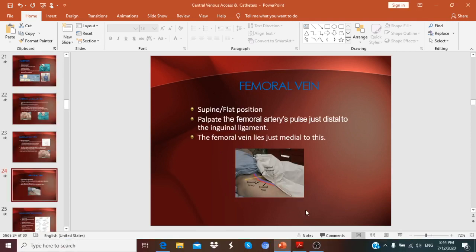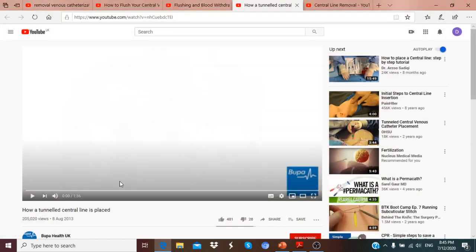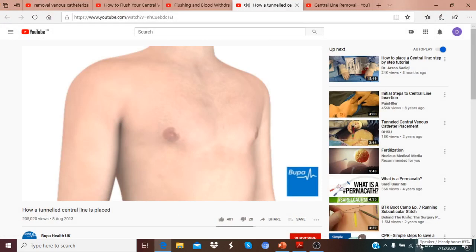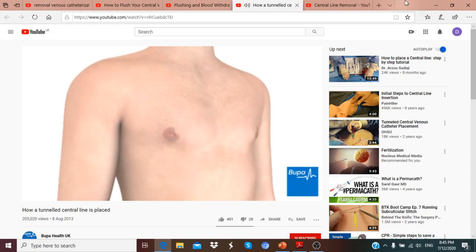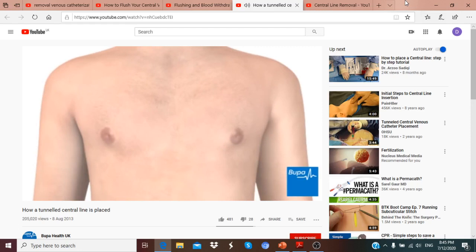Non-tunneled catheters are percutaneous. We have discussed the advantages, disadvantages, and techniques for insertion. The practical component is most important. A video will now be shown. This animation shows how a tunneled central line is placed in a vein close to the heart. You can click navigation arrows to play, pause, rewind, or fast forward the animation.